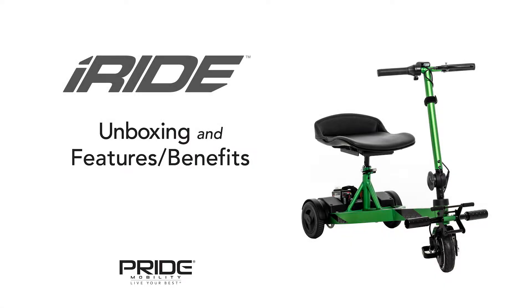Introducing the all-new iRide from Pride Mobility. With its 250-pound weight capacity, this scooter is the answer to a lightweight product that's easy to fold and transport.